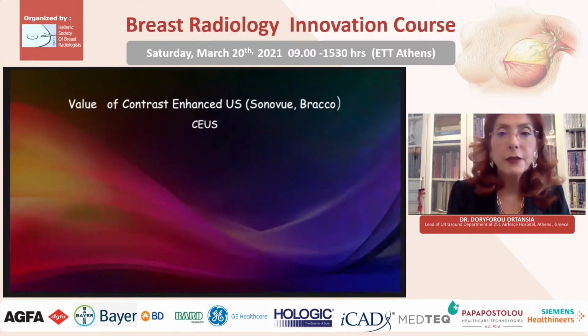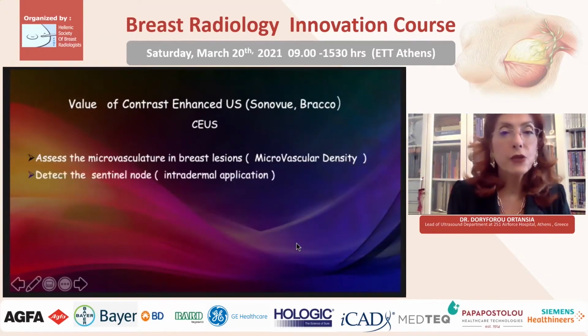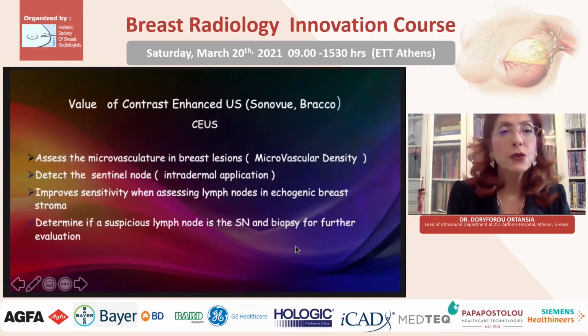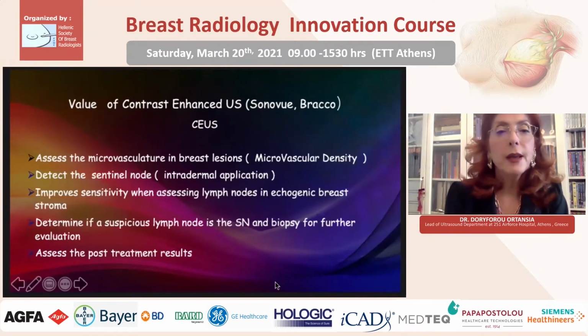It's a non-invasive technique using a specific contrast agent, which allows the visualization of microvasculature in breast lesions, detects the sentinel node, improves the sensitivity when assessing lymph nodes, determines if a suspicious lymph node is a sentinel node, and biopsy for further evaluation, and assesses the post-treatment results.